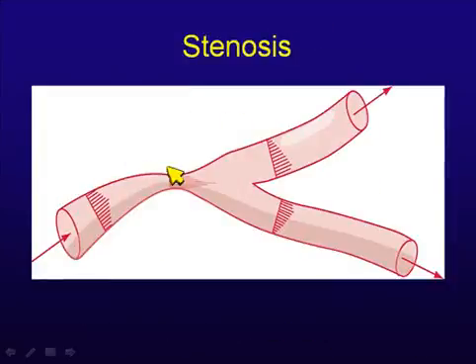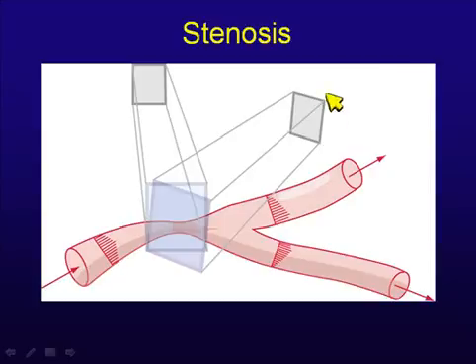Okay, so here's a picture of the stenosis. This is a smooth stenosis. All we care about is right at the stenosis. It might be prudent to sample in 3 dimensions, from 2 directions. That way, if there are any components across the beam, where we can't get Doppler shifts across the field, then we would have another way of sampling it. Now, it's clear that we can do this because there are ways now to do correspondences of images from different orientations. They're very robust, and my guess is that they'll certainly work out to be possible in the future.